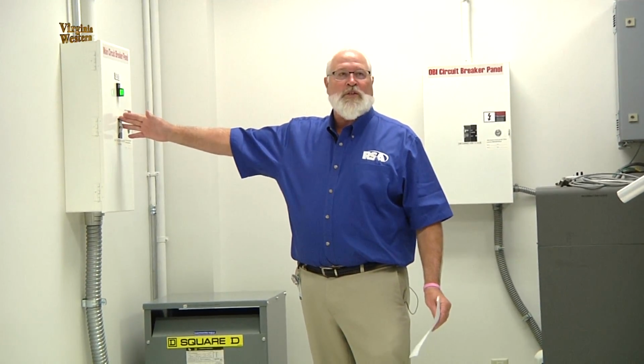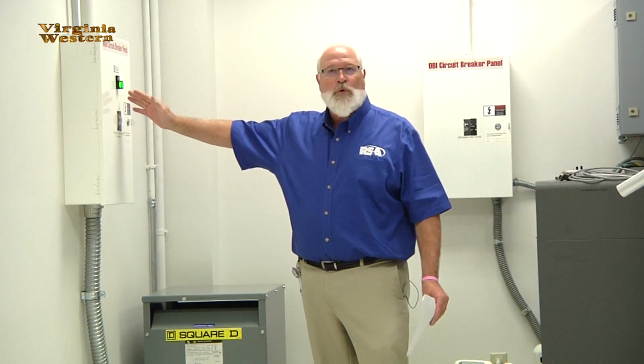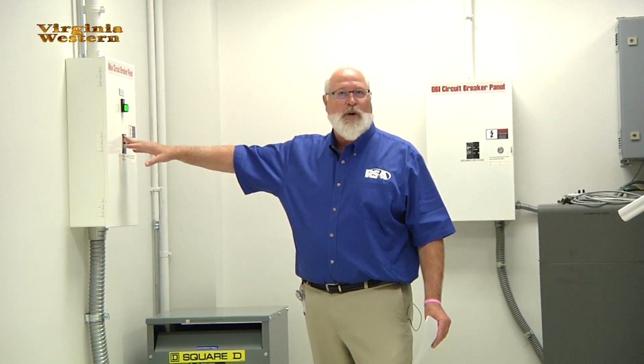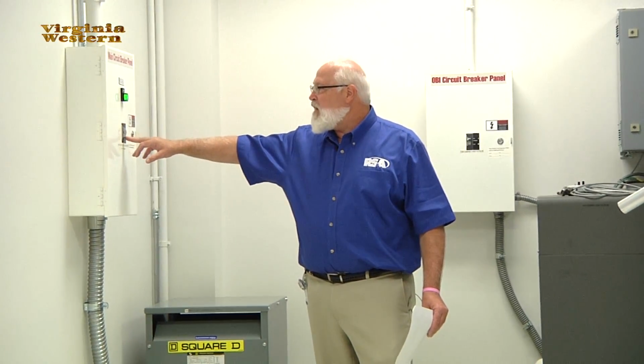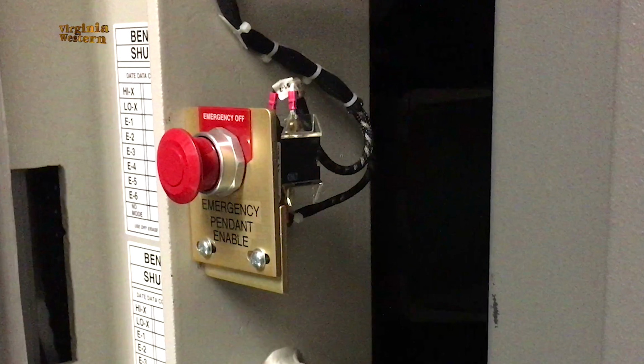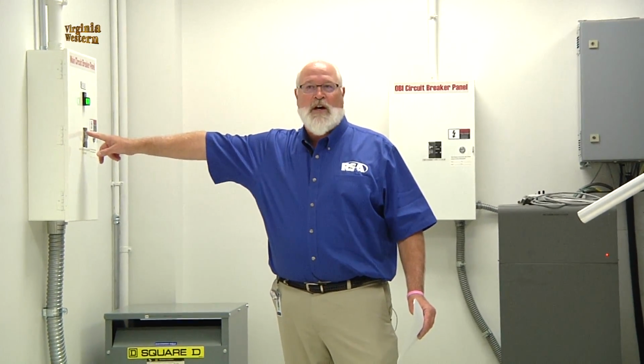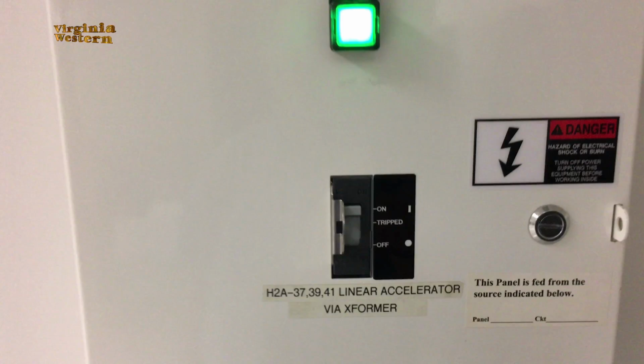They'll give you a startup procedure on your location, and they'll tell you how to reset this breaker. The emergency off buttons are tied into this breaker. So when you hit an emergency off, it'll trip this off. So a lot of times if you can't start this breaker, it's because one of the emergency off buttons is pushed in.